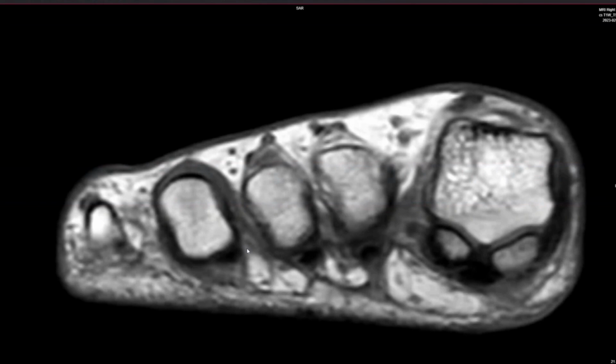But a pseudoneuroma lesion, which I'll show you other examples of in other videos, you'll start to see that the enlargement of the nerve moves towards one of the regions of the plantar capsule. And that's indicative that the region for the neuromatous inflammation is secondary to a plantar capsulitis. So distinguishing the type of inflammatory or perineural fibrosis that's occurring may help us to further distinguish our patients and help them find their forefoot wellness again.